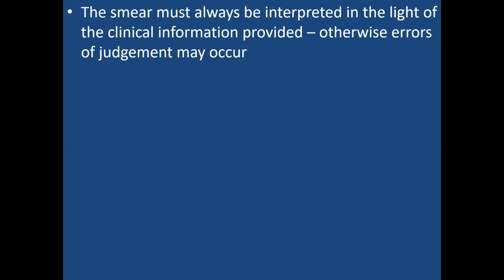So it's possible to see endometrial cells if the woman is wearing an IUCD. But if she's not, then you shouldn't see endometrial cells in your smear outside the first 12 days. So assuming you have a smear, everything seems normal, then you find endometrial cells in the late luteal phase. Based on what you know, this is not normal, and you are likely to make a note of it in your report, which will prompt the clinician to investigate further.